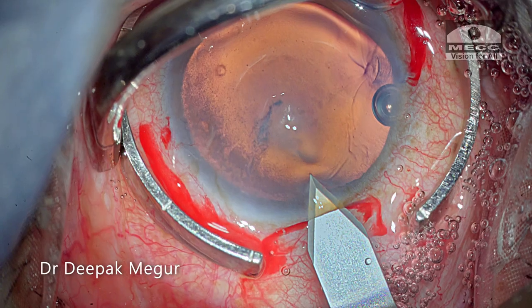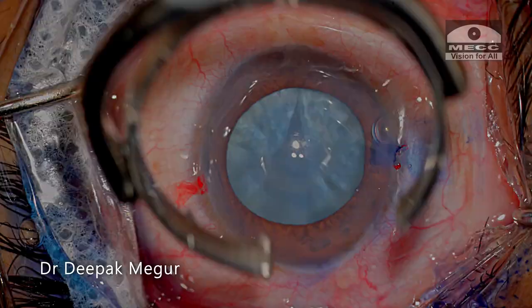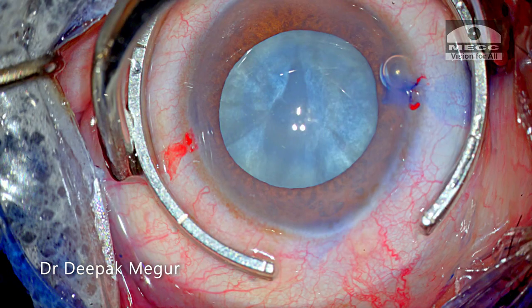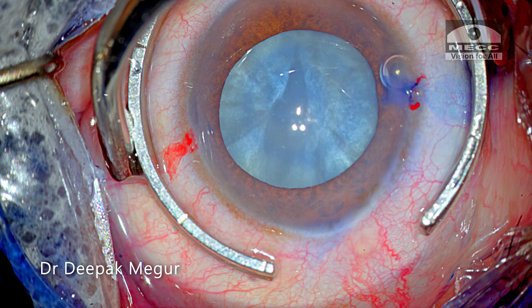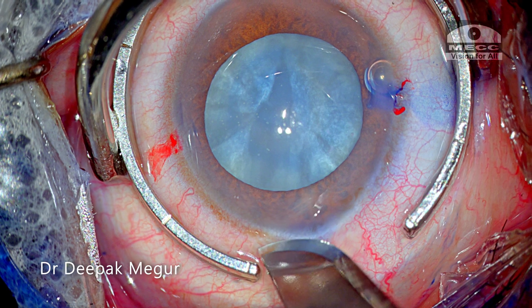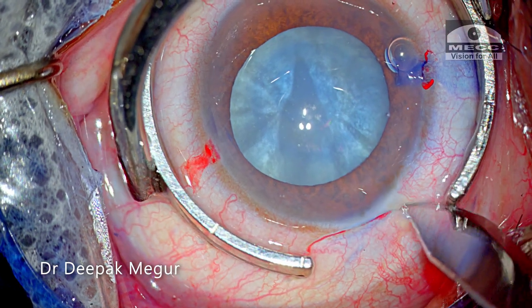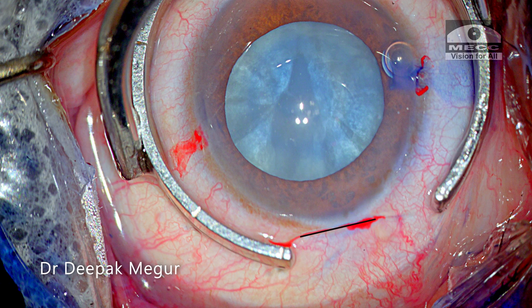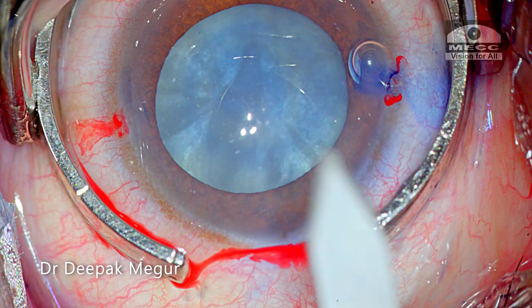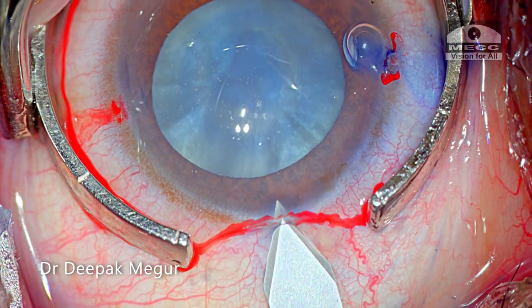Moving on to creating the incisions. In order to create the perfect incision, let's observe the actual technique. The globe is stabilized with the ring. Typically, my incision is posterior limbal — based at the conjunctival insertion or 0.5 millimeter posterior to it. To avoid conjunctival ballooning, I prefer to make a perpendicular partial thickness incision slightly bigger than the intended phaco incision — for example, a 3 millimeter groove for a 2.8 millimeter incision. There will be some oozing, but visibility can be improved by gentle irrigation. The 2.8 millimeter bevel of the keratome is placed in the groove first and the blade is moved up and forward.